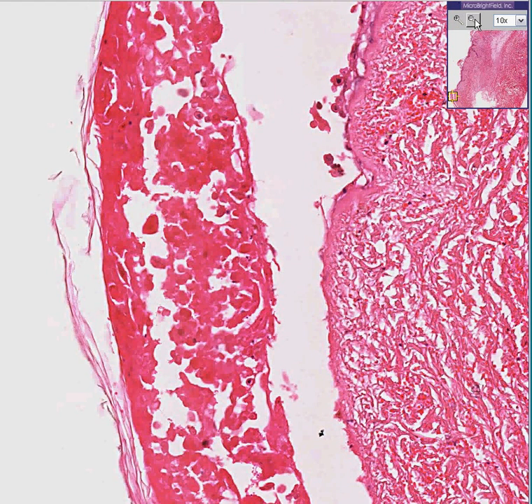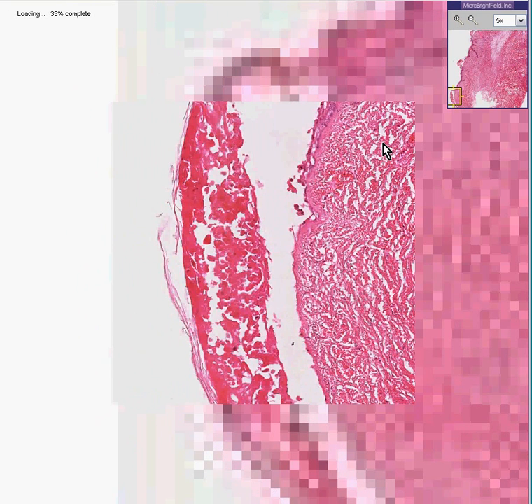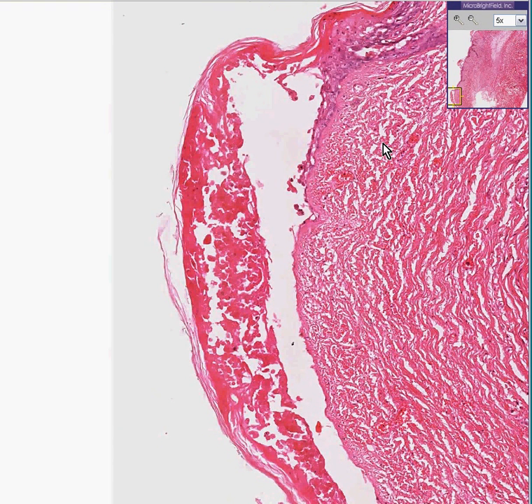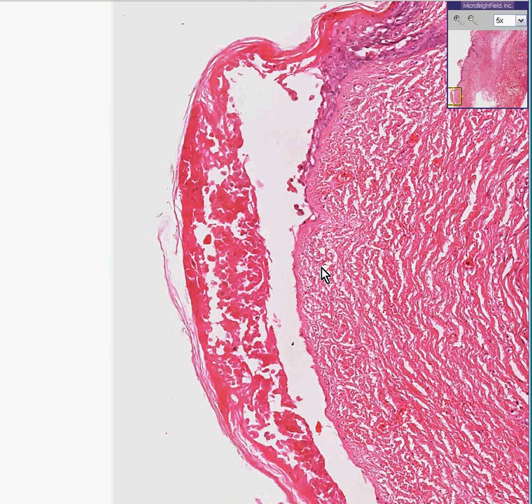Ironically, the same virus that causes chicken pox also causes the vesicles of another lesion, more common in adults, called herpes zoster or shingles. That's why this is called the VZ virus — for varicella zoster. They're both the same virus. This is a classical skin lesion of chicken pox. If you were to ask me could this also technically be exactly what the vesicles would look like in herpes zoster, I would probably have to say yes, because it's caused by the same virus and the vesicles can look similarly, and the virus has the same type of reaction in each case.